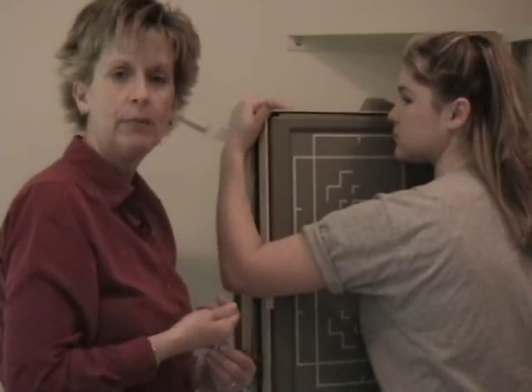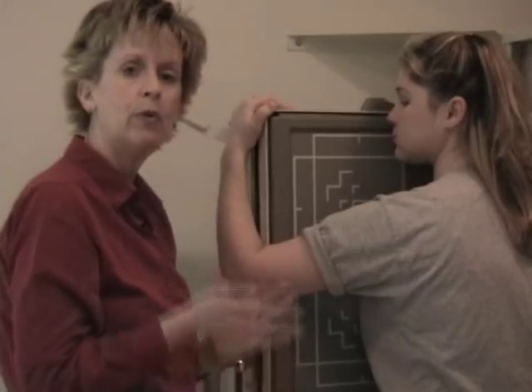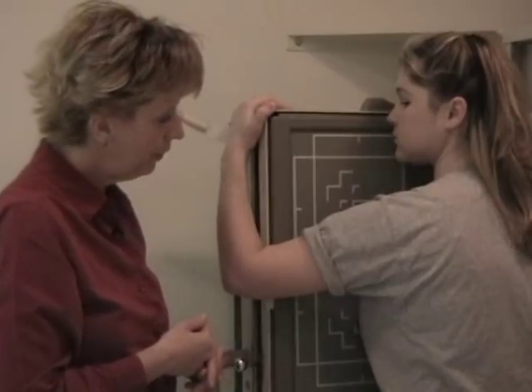That will increase your time, and have the patient continue the breathing process. And that will blur the posterior ribs. And this would be an RAO sternum.